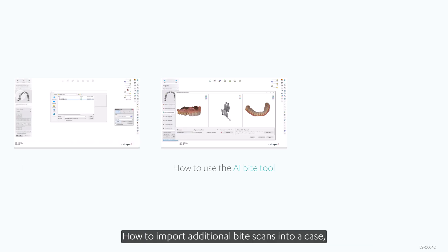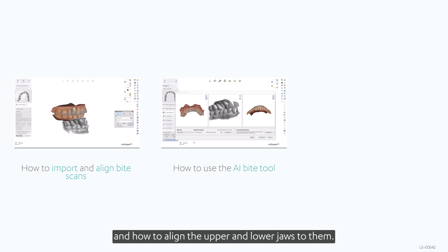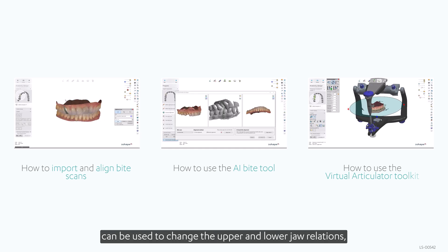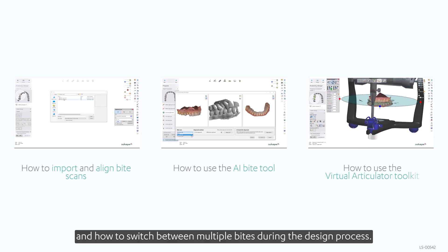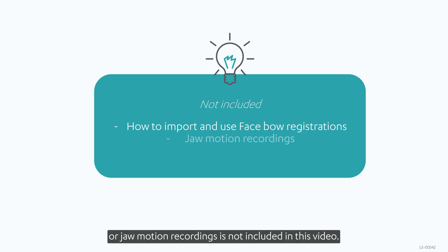How to import additional byte scans into a case and how to align the upper and lower jaws to them, how the broader virtual articulator toolkit and settings can be used to change the upper and lower jaw relations, and how to switch between multiple bytes during the design process. How to import and use Faithbo registrations or jaw motion recordings is not included in this video.